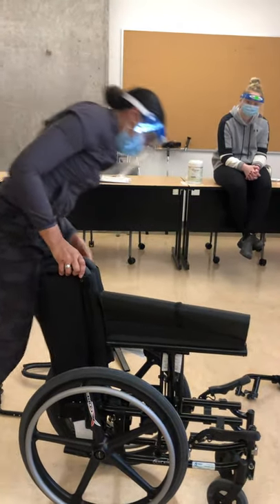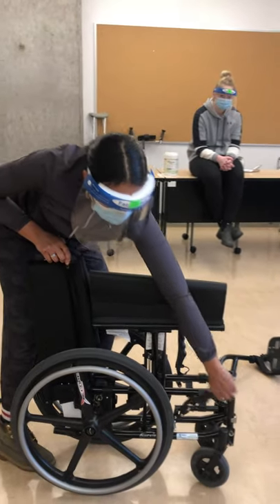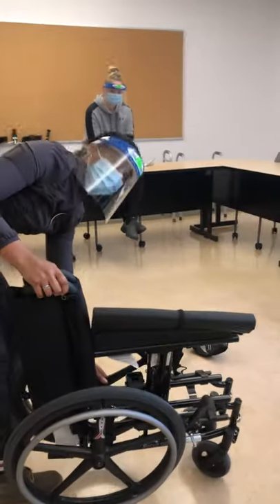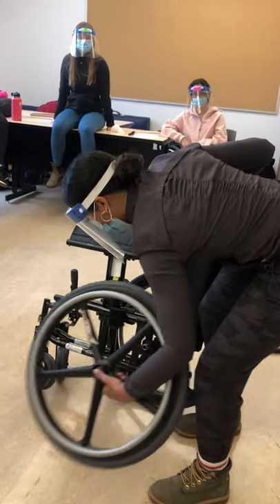Next we're going to do the wheels. We have to take the brakes off to get the wheels off. Tilt it to the side — these wheels have a button in the center that you press and then the wheel slides out.